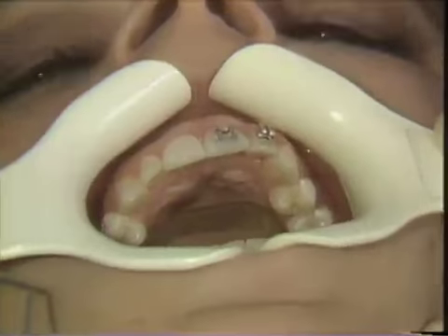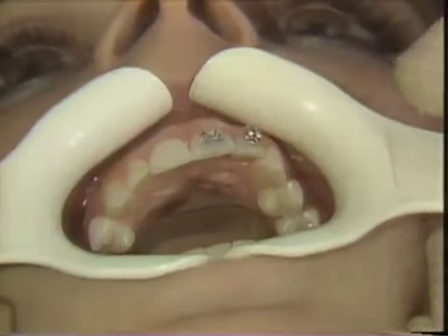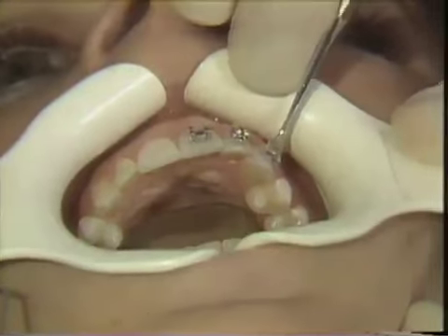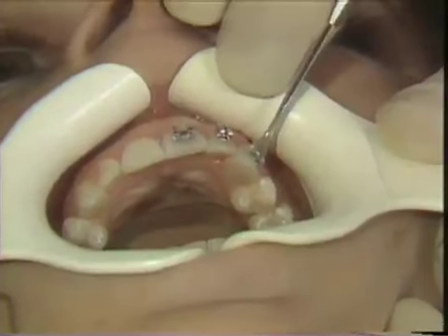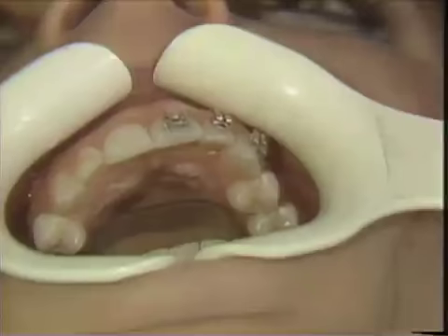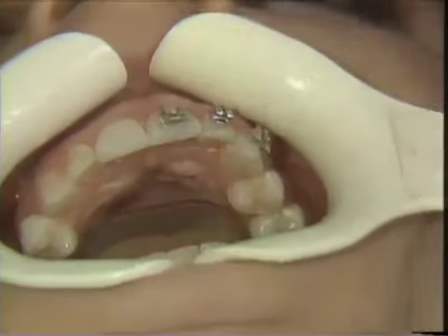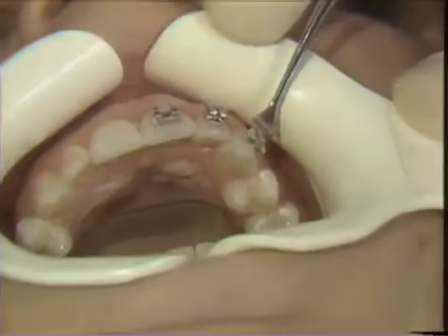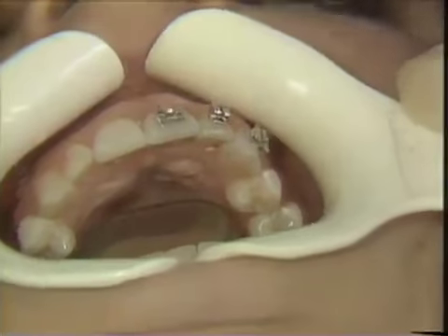Now, in the preparation of this case, the canine bracket did not quite fit the contour of the canine, and so we made adjustments in the contour prior to the time that this procedure was started. Again, checking in the mirror. And positioning the bracket.